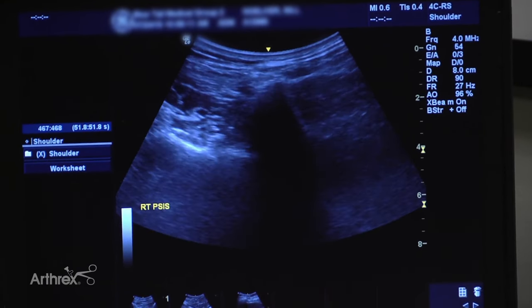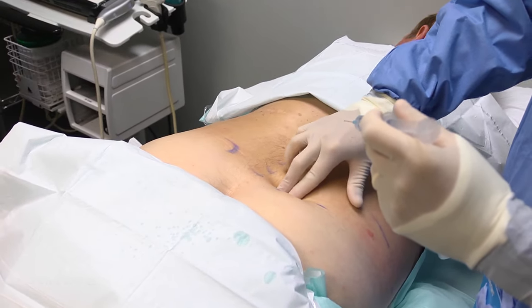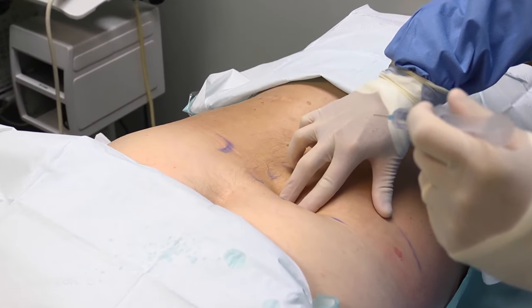But for the most part when you're starting out, this is the easiest spot to go to. We've marked our site already. I usually put in an XY coordinate only — I just put my probe on transverse, get an XY coordinate, and we'll get ready to get some bone marrow.